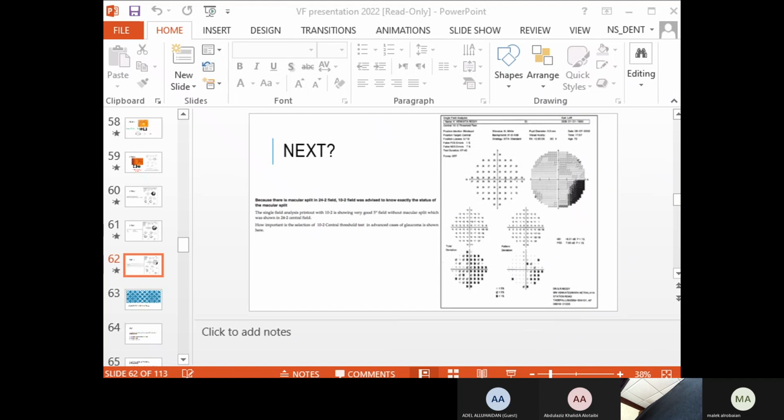Why is that? Fixation is good. If the fixation is high, it can give you that. That's one other thing. A patient should not see in the blind spot, but if they do, what does that mean? Trigger happy. Yeah, they can be trigger happy if you have high false positives, but it's not zero here. You can see the gaze tracker shows high movements here compared to this one.